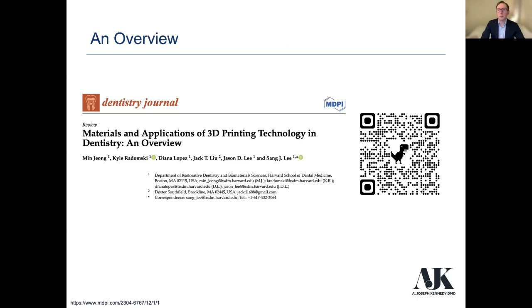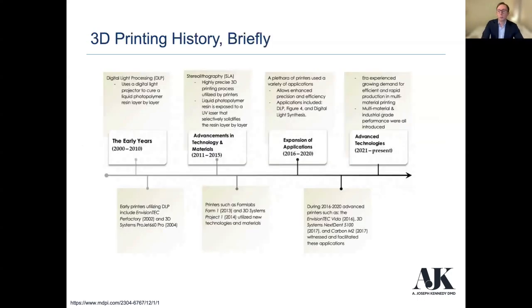So I've highlighted just some aspects that I felt were important to discuss tonight. When we look at 3D printing in general, you can see the early years were the 2000s. We had digital light processing, or DLP.